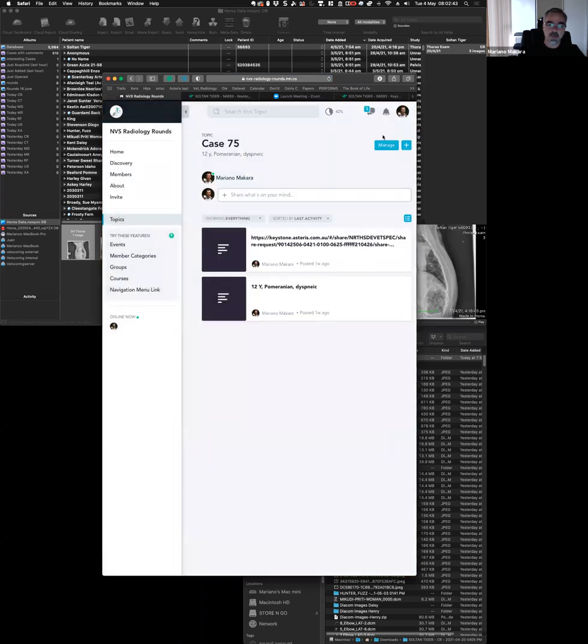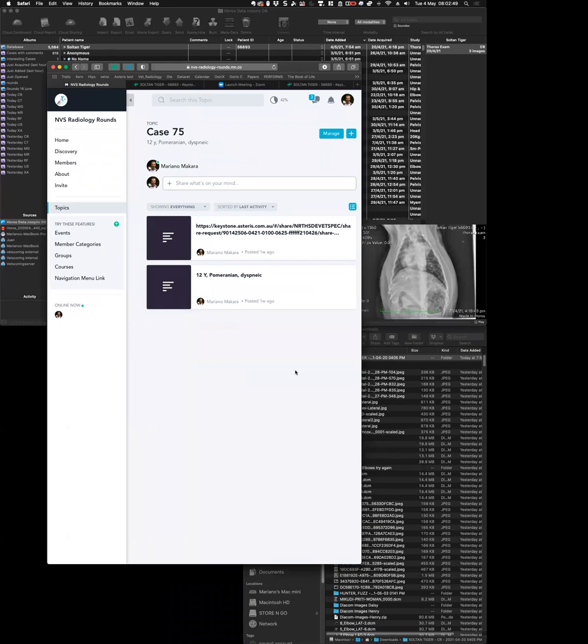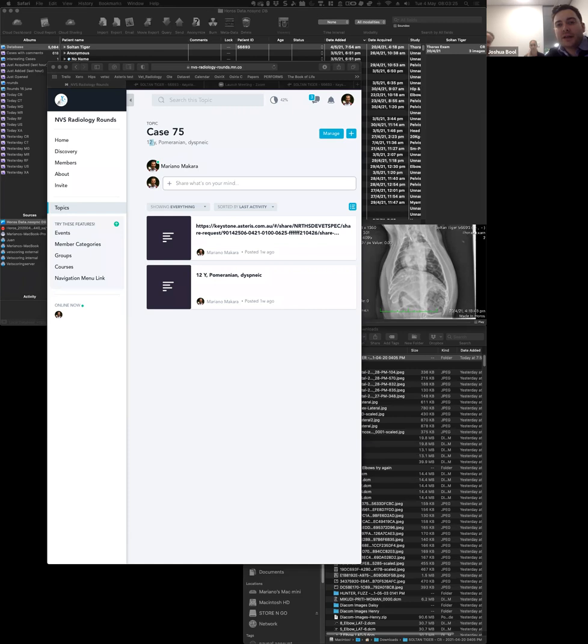They're all real, but this one is real because it's not taken from my library of cases, but rather it's a case that showed up in the clinic. George, maybe you can give more background. I forgot to update this. When I got this, I just put whatever I remember from walking by the case, which is that it's an older Pomeranian that presented dyspneic, but I think was also cyanotic. Just correct me if I'm wrong. Yeah, it was cyanotic. I think initially on presentation, it was put into oxygen and then didn't really respond until it got its sedation.